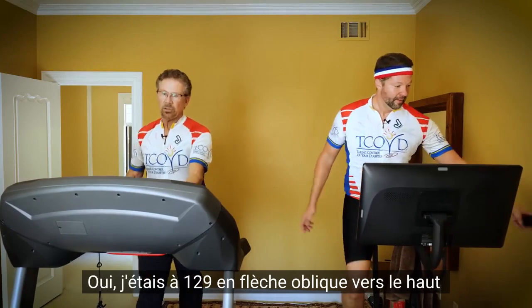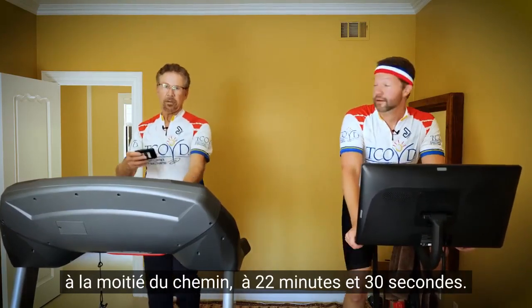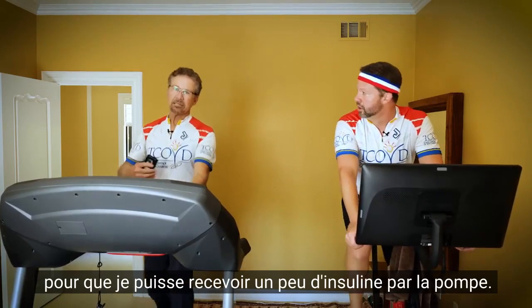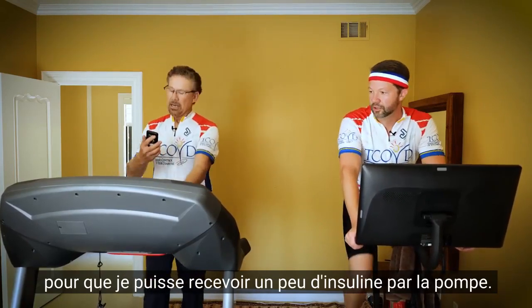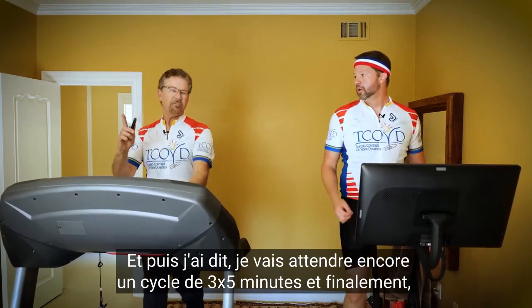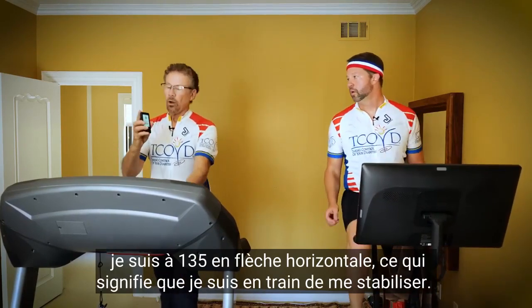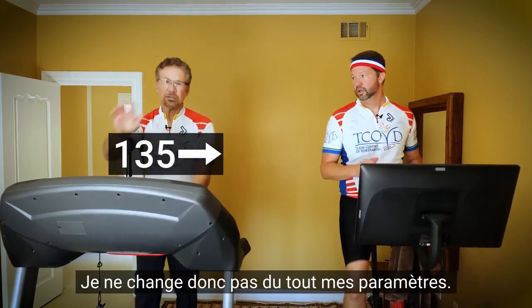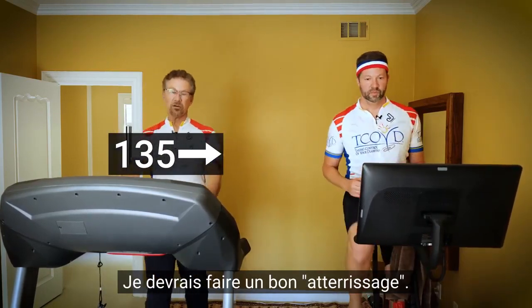Yeah, I was 129 diagonal up at the halfway point, 22 minutes and 30 seconds. And I said, I'm gonna turn off my settings so I can get a little insulin through my pump. And then I said, I'm gonna wait one more 5-minute cycle. And sure enough, 135 straight across, meaning that I'm leveling off. So I'm not changing my settings at all. I should come in for a good landing.